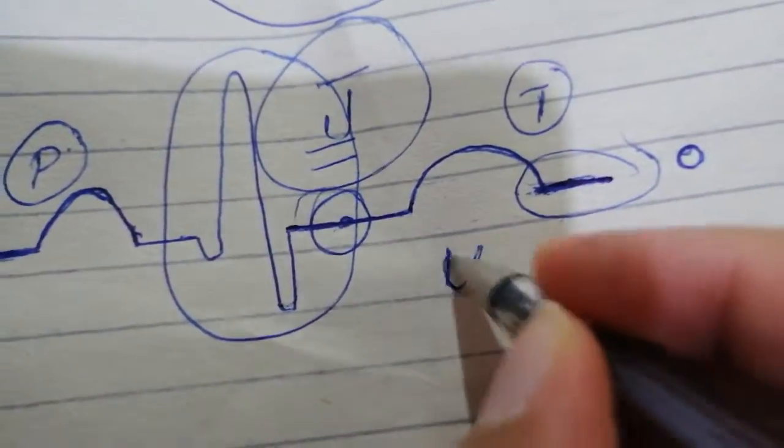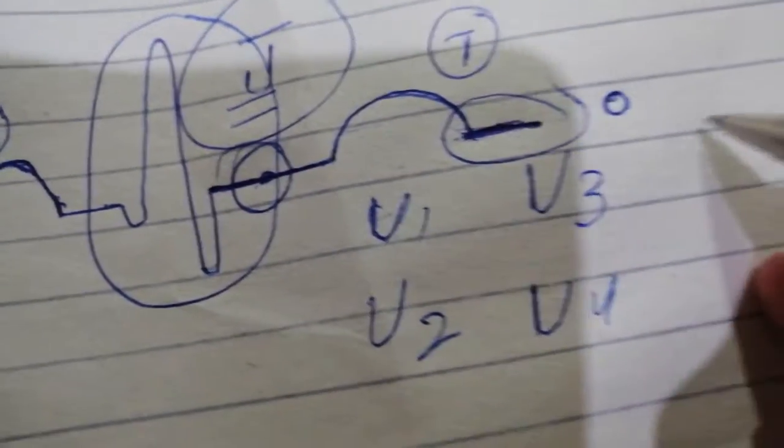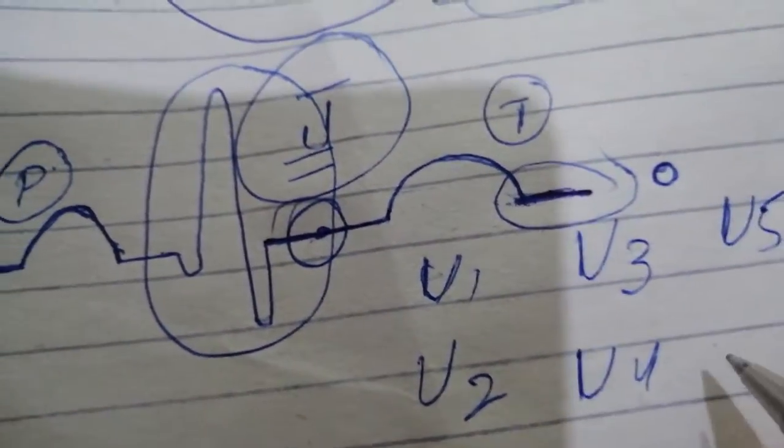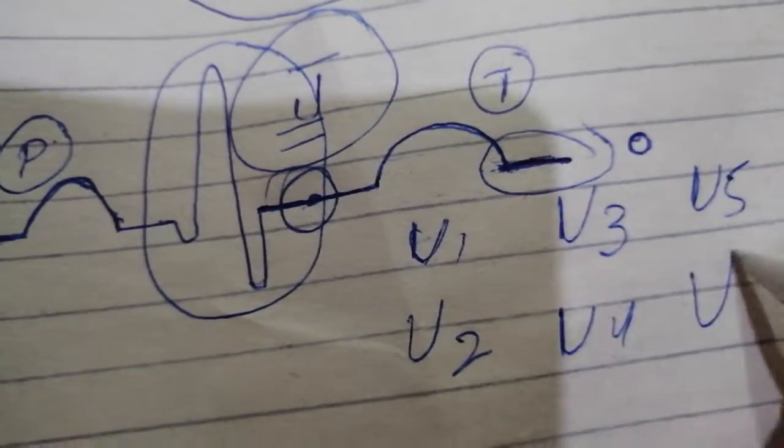By using the leads V1, V2. They're placed at different spots, and different leads look at different areas and different aspects of the heart, so you know where the infarct is located.